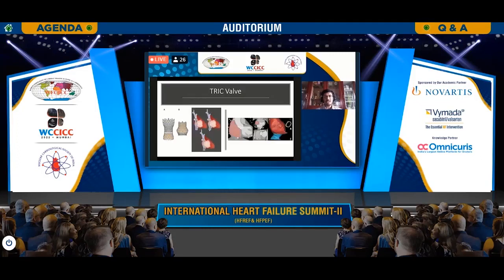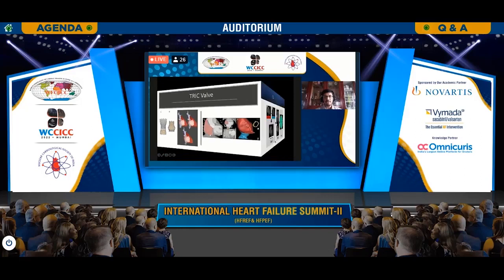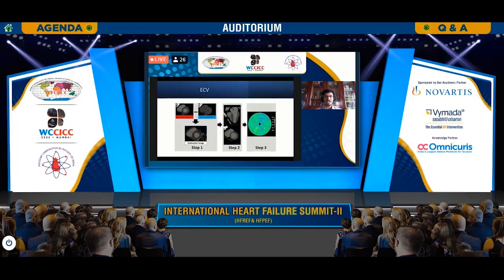Now, we are also seeing significant cases of RV dysfunction with tricuspid regurgitation, and we know that the tricuspid valve does not lend itself to intervention in more ways than one. So a very useful way of plugging the SVC and IVC and preventing the tricuspid leak from going above, using the TricValve, is a very, very important tool that is now coming to the fore. And CT is very exquisite in creating a virtual map of the SVC, IVC, and the RA, and also for the myriad measurements that are required for the SVC and IVC valve placement.